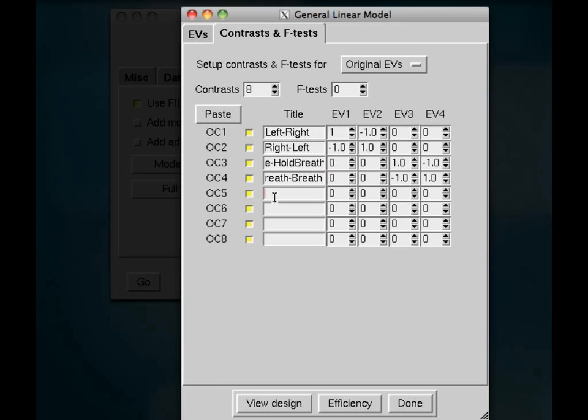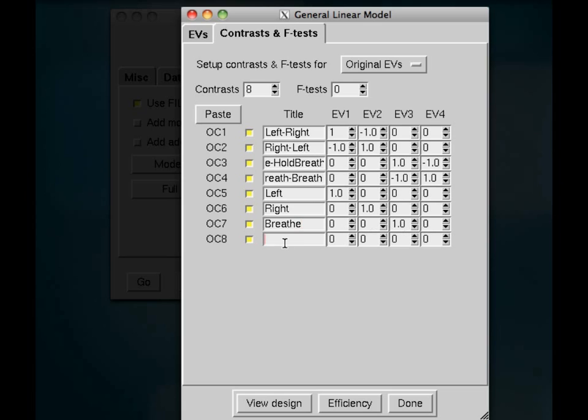Now, this is also good practice just to calculate a beta weight for each of your conditions alone, because contrasts, while they're useful, you can also lose some information once you start subtracting beta weights from each other. So I'm going to just calculate a beta weight for left, just assign a weight of 1 for EV1. Same thing for right, and you get the picture.